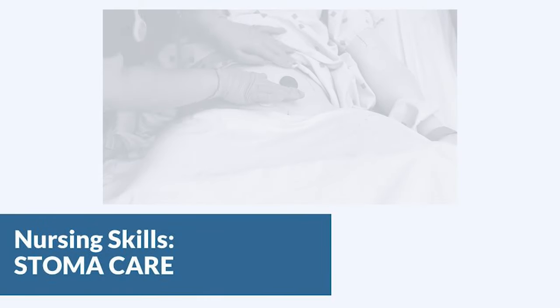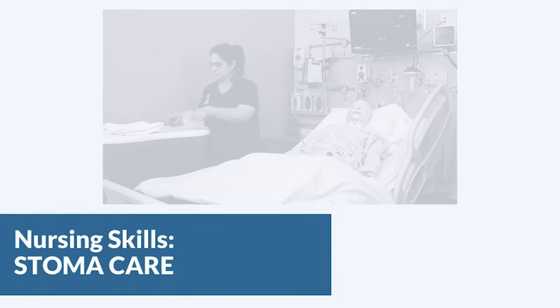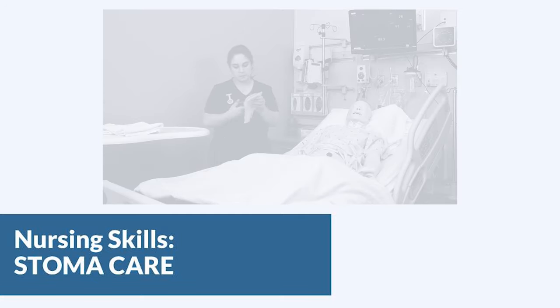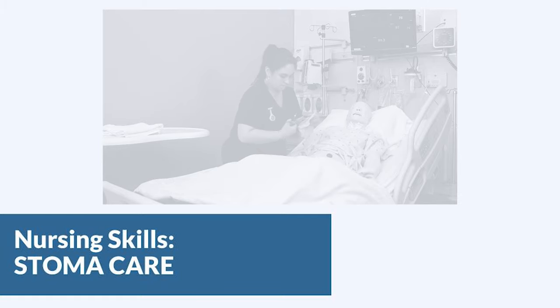In this video we're going to talk about stoma care. The wafer and bag for an ostomy only needs to be changed every three days or if it's leaking, but you still need to be able to assess the stoma itself. In this case we're going to show you how to replace the bag and clean and assess the stoma.